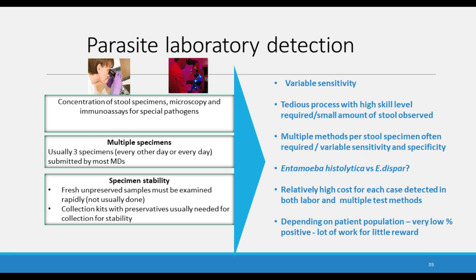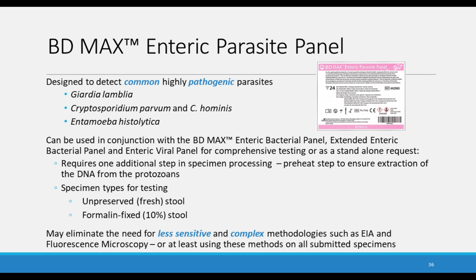And I don't know about your population, but in my population, we have a very low percentage of parasites. So it's really been a very big frustration for people in my laboratory. Although they greatly appreciate the science of parasitology and they think that it's an amazing science with all of the organisms and everything that goes with the detection of parasites, they do so much work and they get so few positives that they don't really get very much reward in what they're doing. And that's always been an issue in our laboratory. So I have to say that the one celebration that we had in our laboratory was when we switched over from manual parasitology to doing molecular testing, because it was just really greatly appreciated by our technologists in our laboratory.